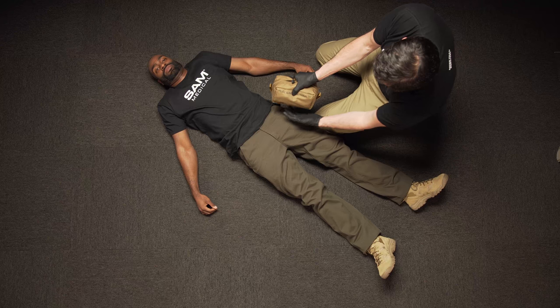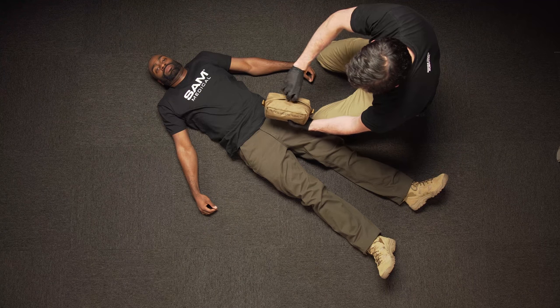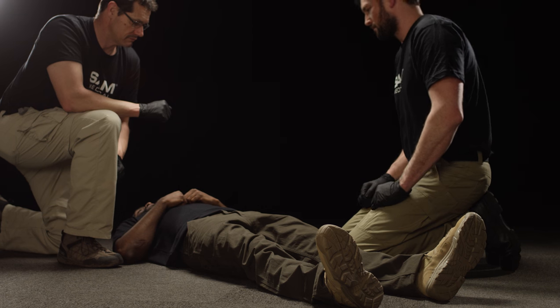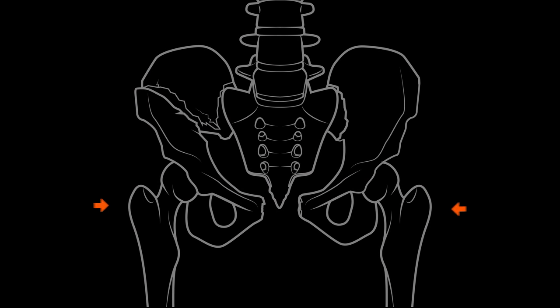Before applying SJT, your patient must first be exposed to the extent that is appropriate for the given situation. If possible, a second responder should apply direct pressure to the femoral artery while you prepare SJT for use. Locate the bony prominences on the side of the hips — the greater trochanters — where SJT should be applied.